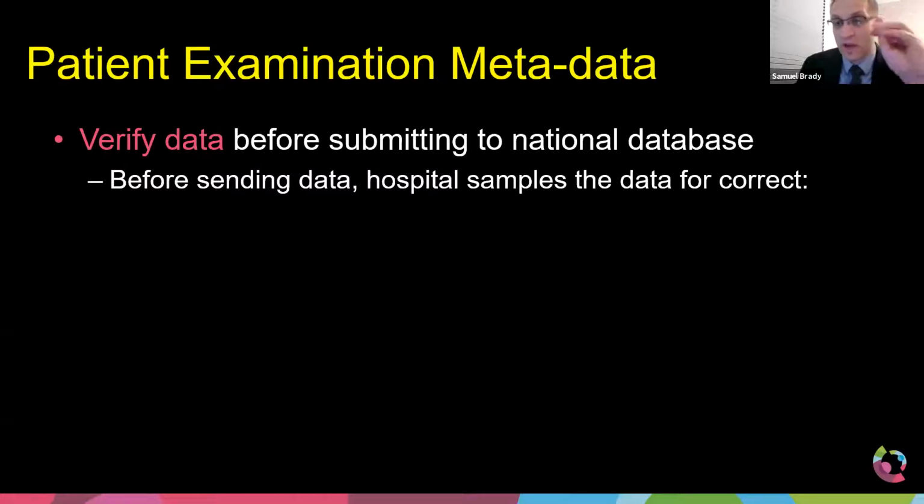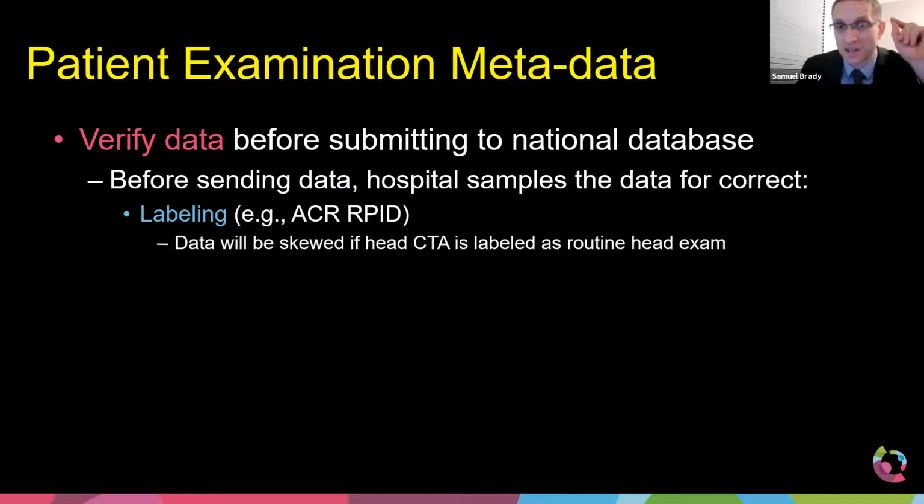All right. Assuming now you have that software installed, and now you've collected that data, before you submit it to the OAP, you need to make sure to verify that data. Because if it's incorrect, well, obviously it skews the results and it just makes the results unanalyzable, makes them poor.